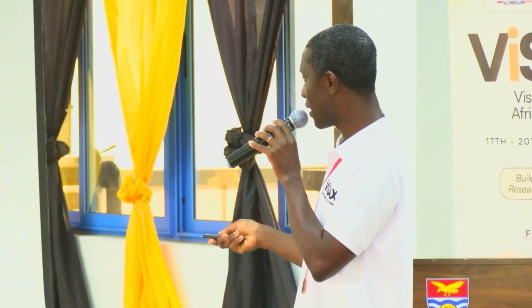So there's a standard for dark adapted, and I need to mention this as well. We know night blindness, right? So people with night blindness can't see at night. They are fine in the day. Then we have albinos who are fine at night and have problems in the day. So if you are testing certain conditions, you have to test it in these dark adapted conditions and light adapted conditions. You'll be hearing the word photopic and scotopic.